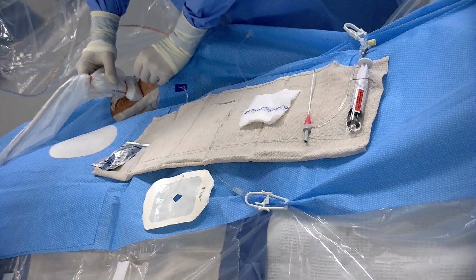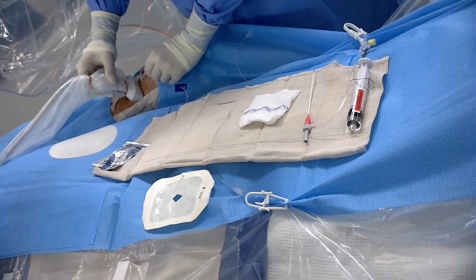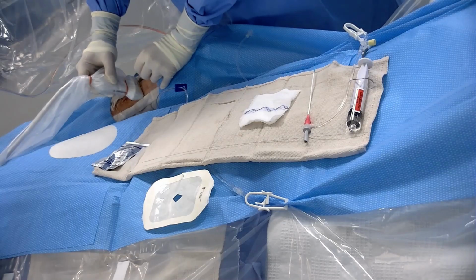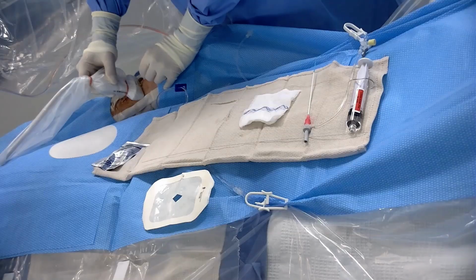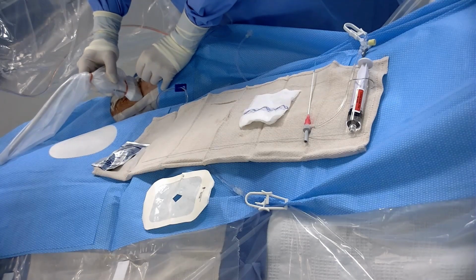So again, in terms of radial access, it's sort of like a shallow angle into it. We did check a Barbeau beforehand. It was a Barbeau B. John's getting stuck there. So yeah, and then we'll go from there. We did prep the right groin just in case. Sometimes these patients are taller on the inside than they are on the outside, but I think we'll actually be okay and go from there.